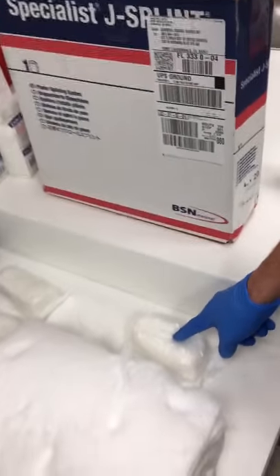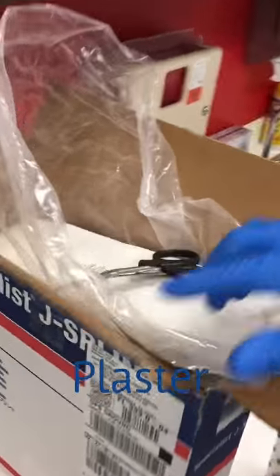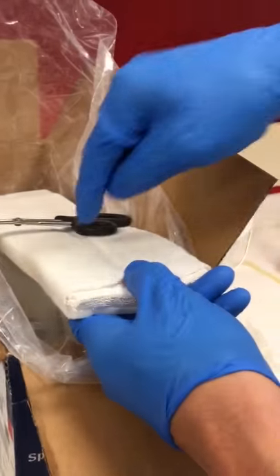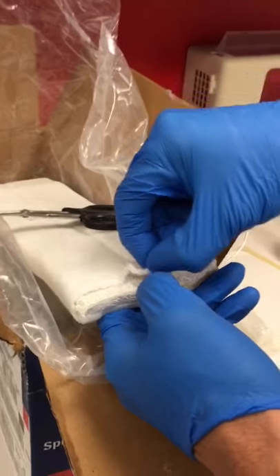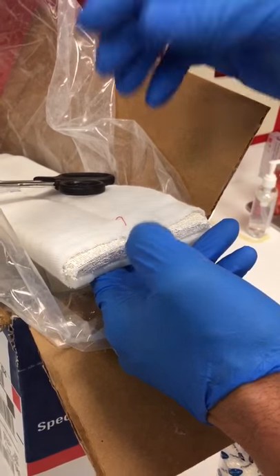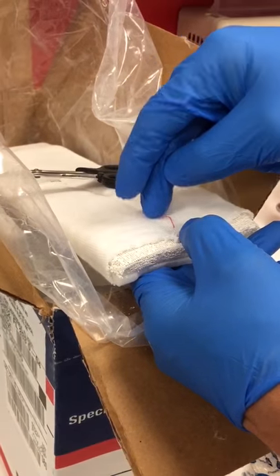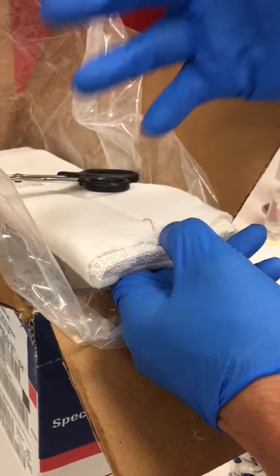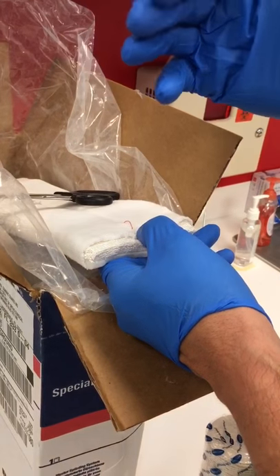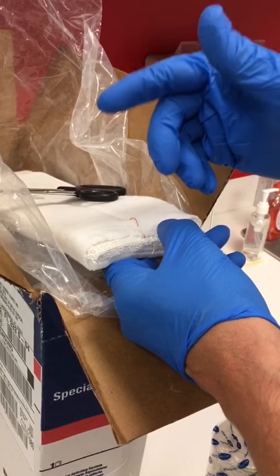Above the 4 inch Curlex, we can then put on our plaster. This roll already has, in this setting, a wrap on top of it. If you use plaster alone, you do want to put web roll on both sides of the plaster, because the plaster itself is very sticky to the Curlex dressing. It becomes very difficult to take off the dressing if you apply plaster directly to the Curlex.